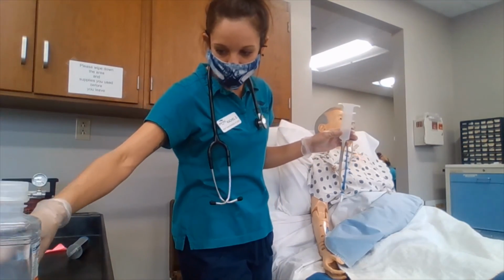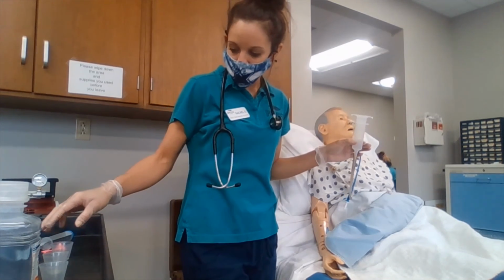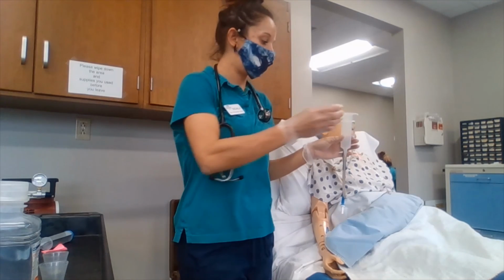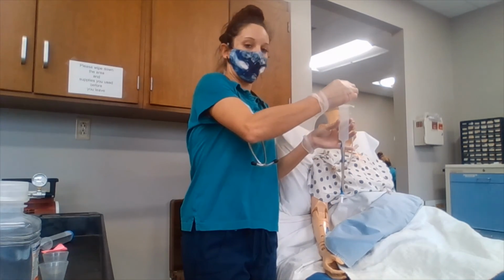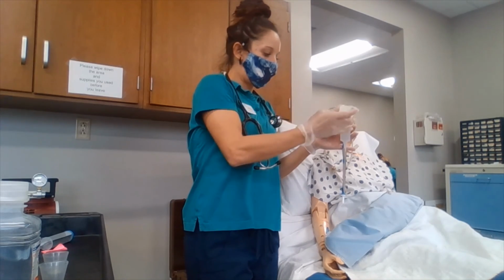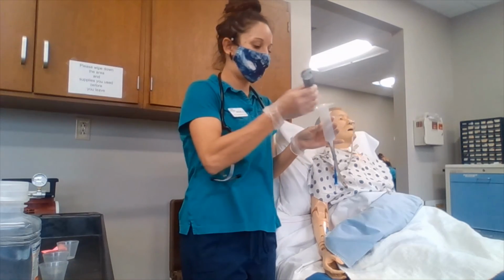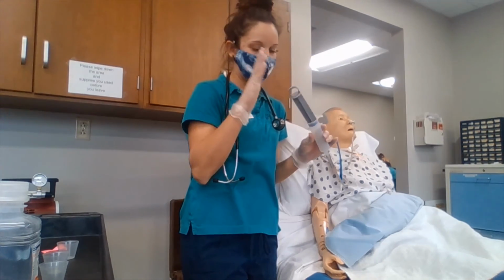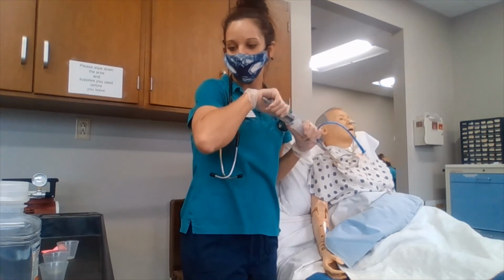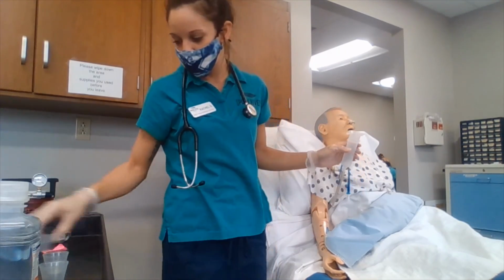So here I have 3 different types of medication. First thing we're going to do is we can either do it by 2 methods. We can either pour it into the syringe and let it flow down, or we can also use our plunger to distribute it.